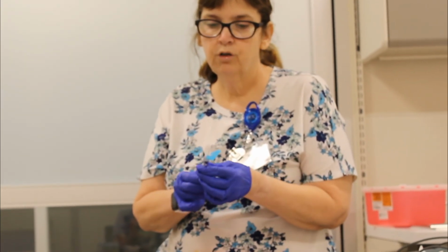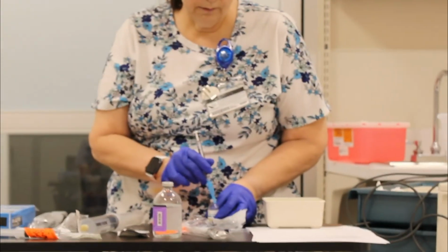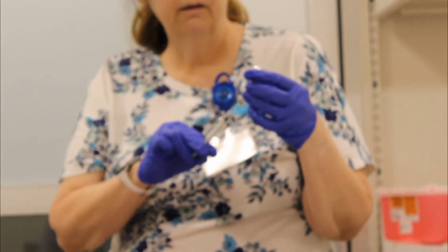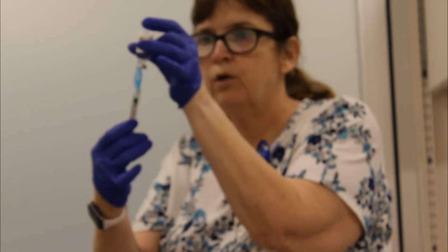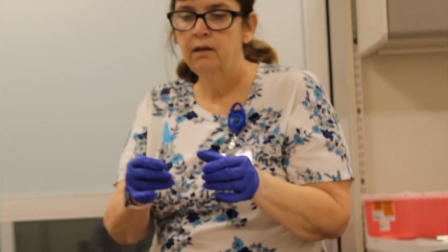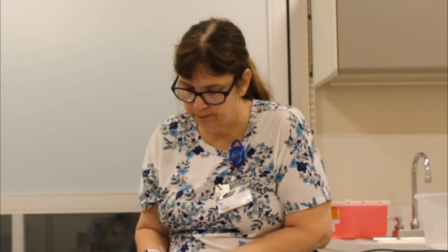I'm going to draw up my insulin. Because it's insulin, I want to validate that with my colleague. In this case, I'm going to close my safety device so that I can set this down. You never want to set down a syringe with an open end. Label my insulin. The last one is Lasix.